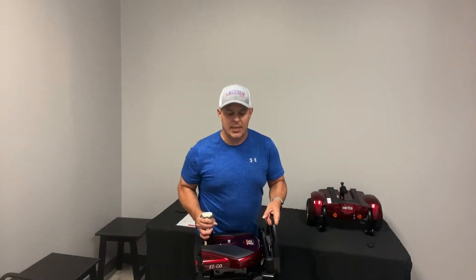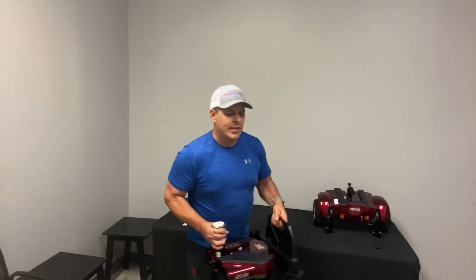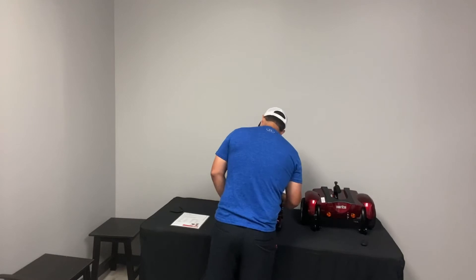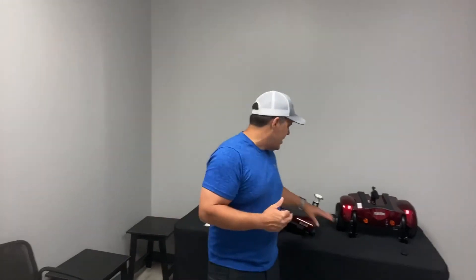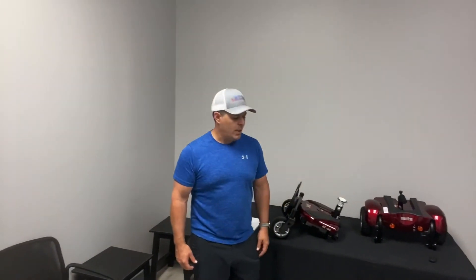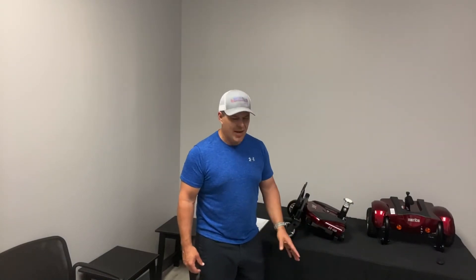When you pick it up, you pick it up just like this, so it's very easy to handle — not an awkward pickup. The total unit is only about 100 pounds. You break that down: 42 pounds for the front piece, and the seat is around 20 to maybe 25 pounds, with the rest making up the remainder.